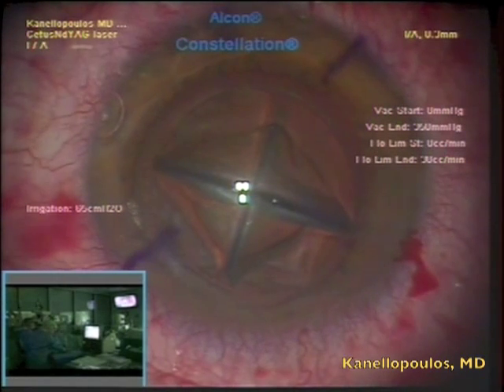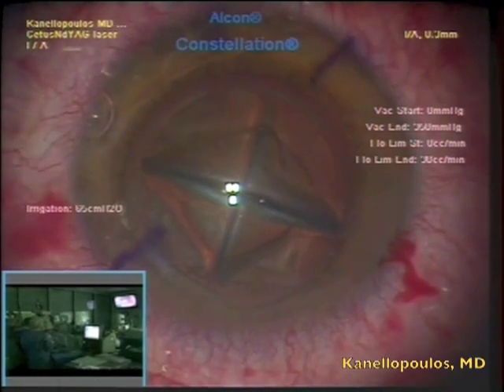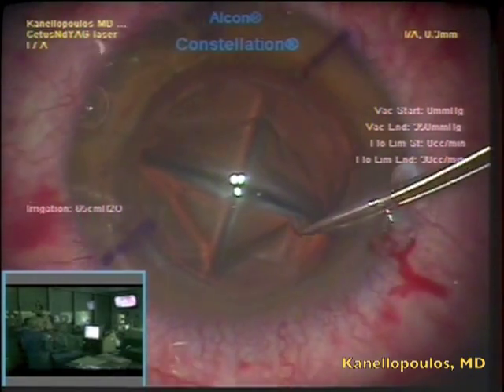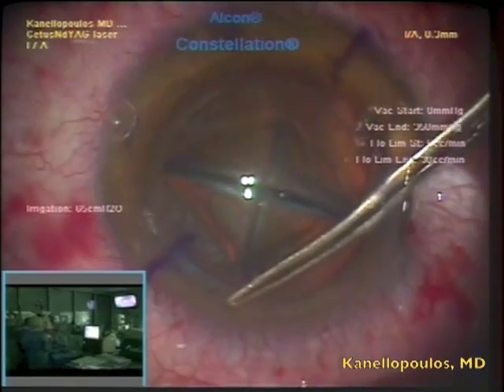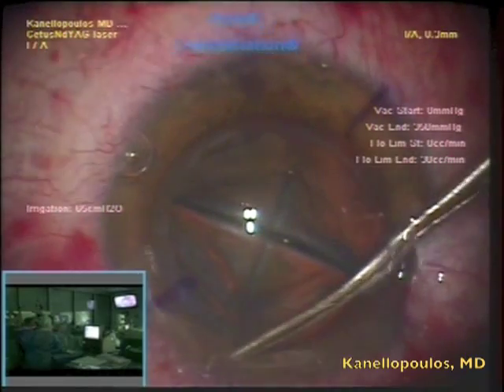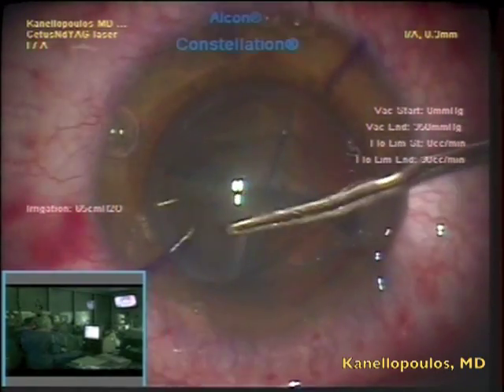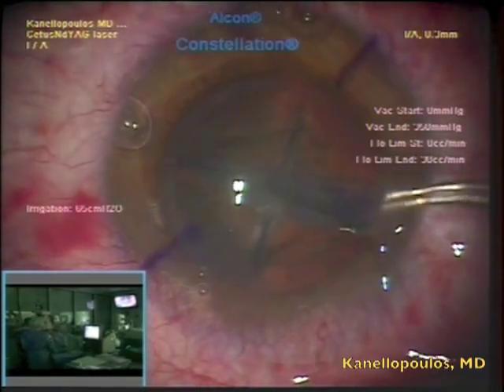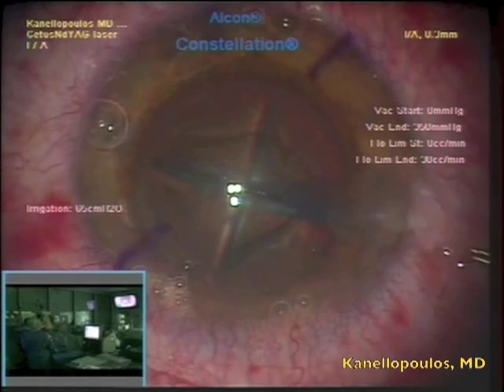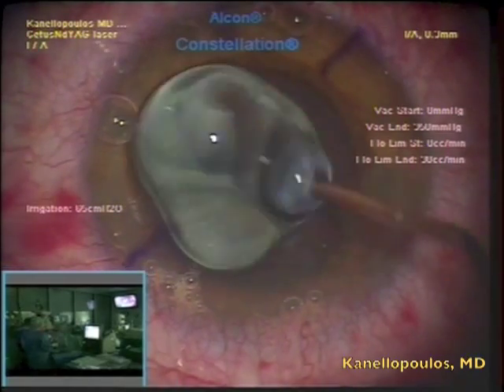So I will have to go in and find where the free cap of the capsulorrhexis wandered into the anterior chamber, following filling the chamber with viscoelastic. I will enter here with a set of capsulorrhexis forceps — not to perform capsulorrhexis, but to try and identify where the capsulorrhexis cap is. I've kept both the initial femtosecond laser part of the procedure and this part at real time. This is unedited. Here I'm able to grasp the free-floating capsulorrhexis. It's tricky because sometimes it contains some cortical material as well, thus confirming we have a free-floating capsulorrhexis.